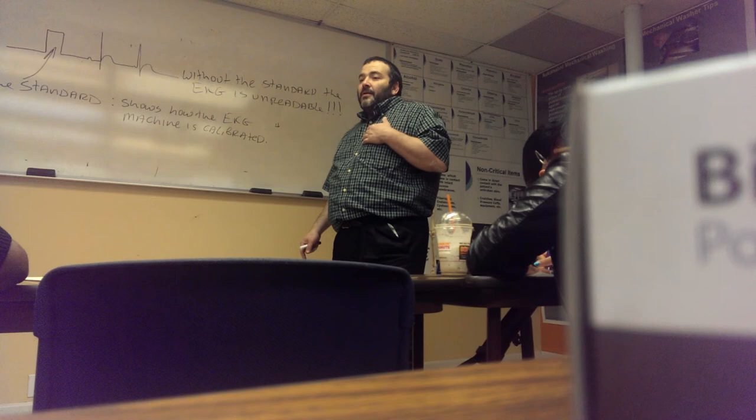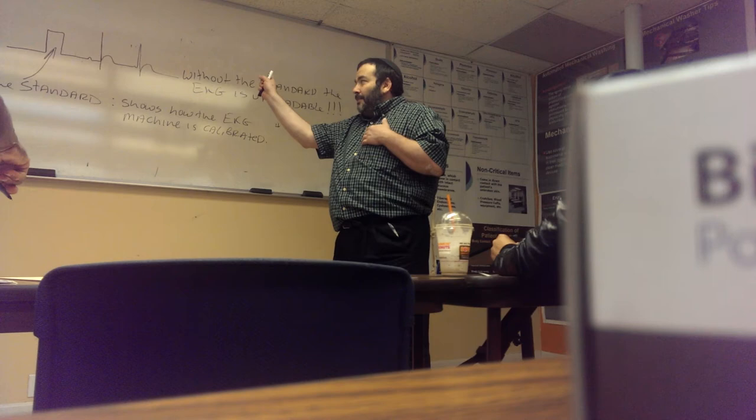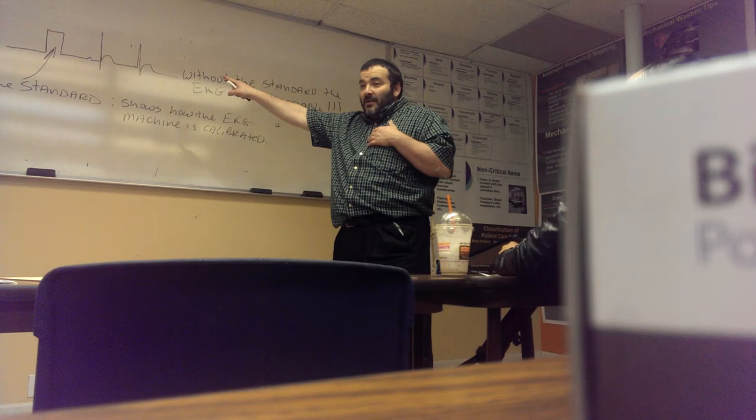When you say without the standard, are you talking about that mark right there? That's exactly what I'm saying. That mark is called the standard, and without that mark, that EKG is unreadable. The thing that goes up and down is the standard. What am I pointing at? On the box. That box is called the standard. See that? You see it? Yes. Say yes. You got it.